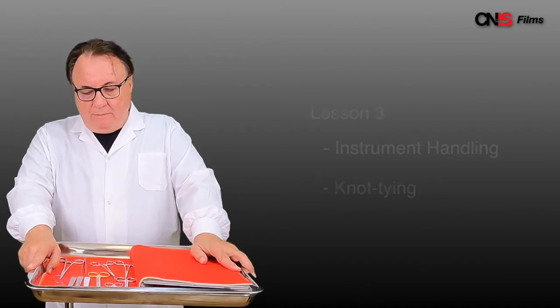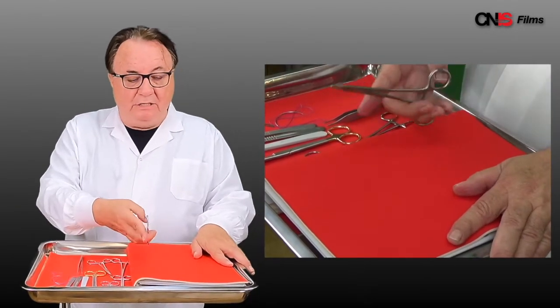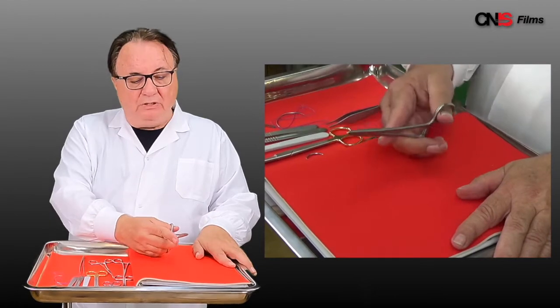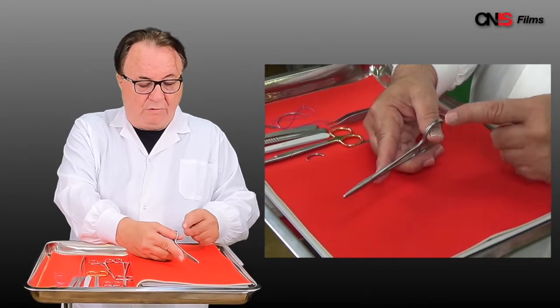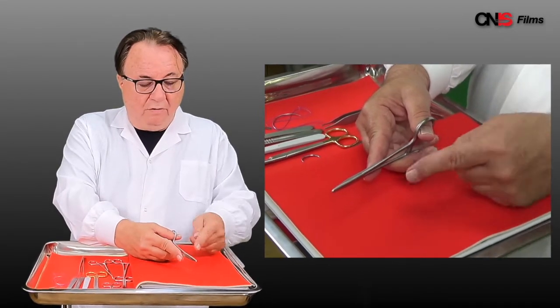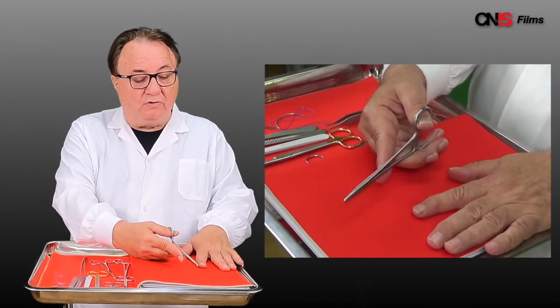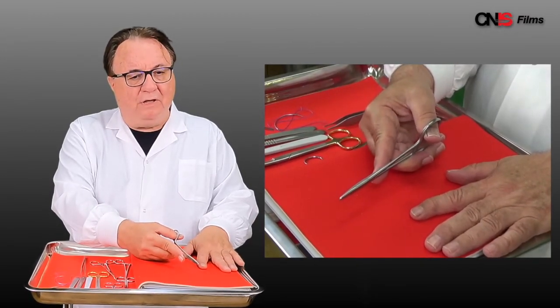Instrument handling. The principles are uniform irrespective of the type of instrument. The major issue is three-point control. Here I have the needle holder. My thumb, my fourth finger and my index finger are controlling the management and the movement of the tip of that needle holder.